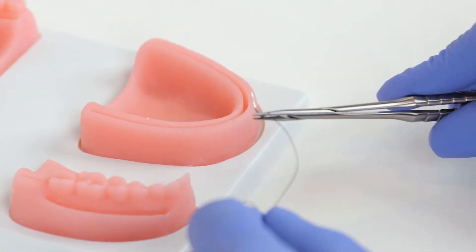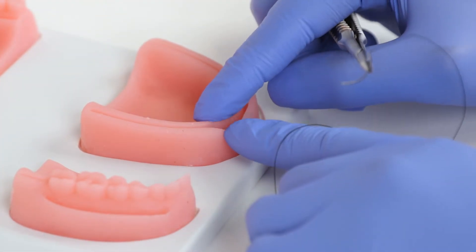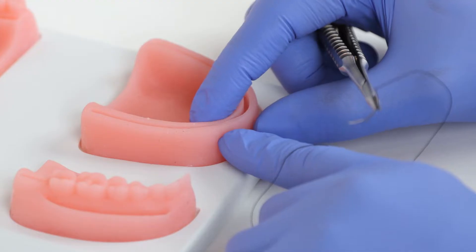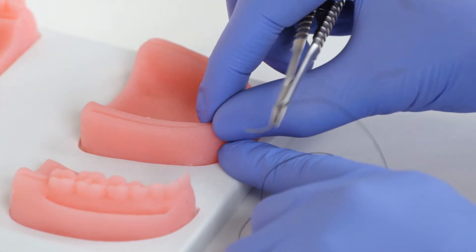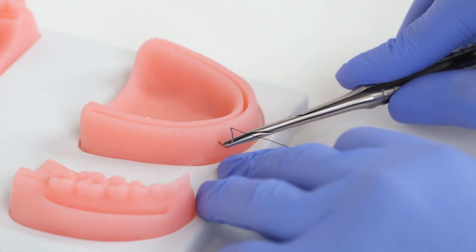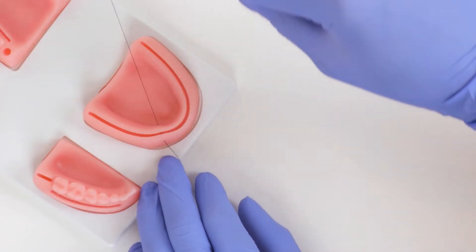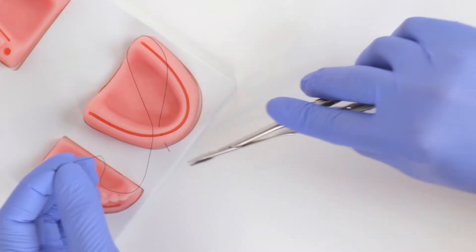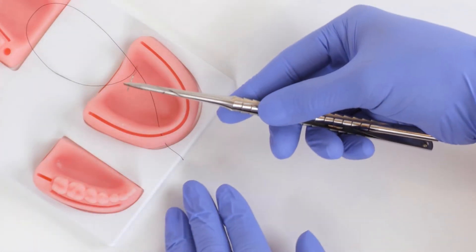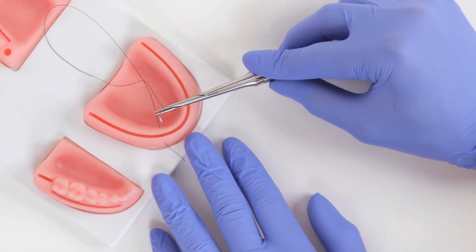The horizontal and vertical mattress sutures are very useful to reduce tension in a flap. If the flaps are having a hard time coming together, or there's going to be muscle pull, you want horizontal mattresses to help reduce tension at the edge. We first start a little distal and make a full pass of the needle through the tissue, then regroup the needle. The first pass was buccal to lingual.